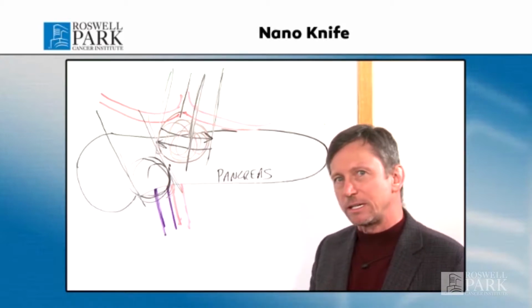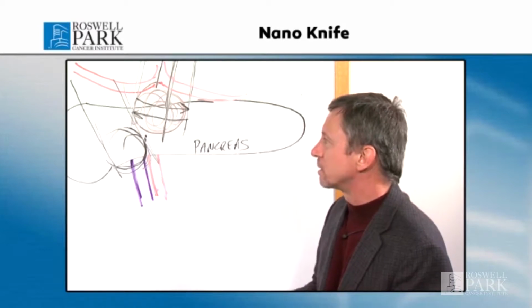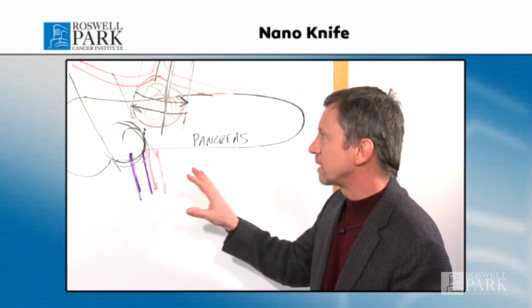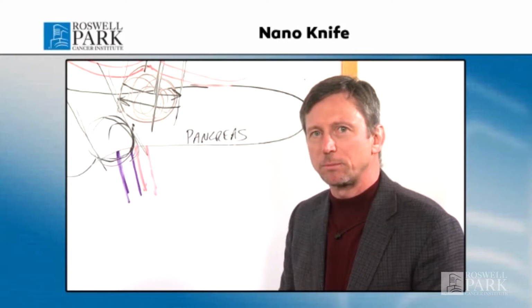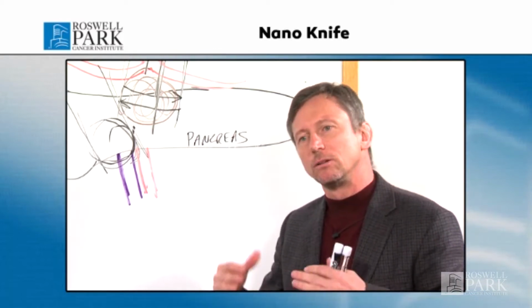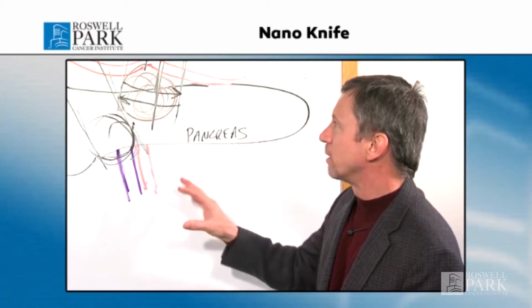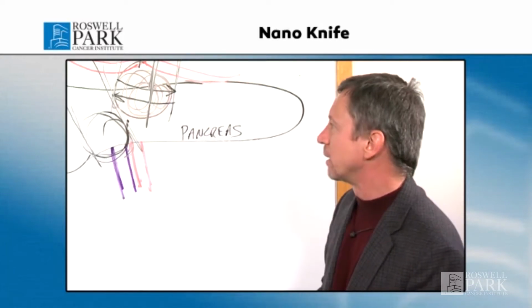There are not a lot of studies showing long-term outcomes with NanoKnife. It would be considered by some insurance companies, quote, investigational. However, we have done a number of these cases, and they're done in about 50 centers throughout the United States. So it is a more commonly performed procedure, but at this point in time, we really don't have any long-term results in terms of cancer survival after this procedure. But we do know that it can be done, and we are doing it for pancreas tumors.